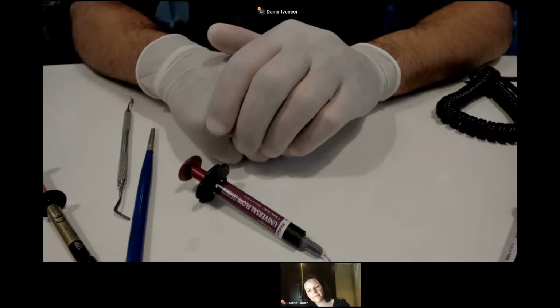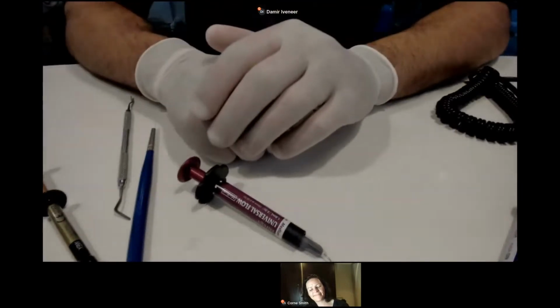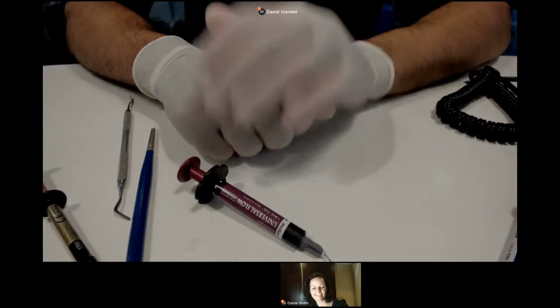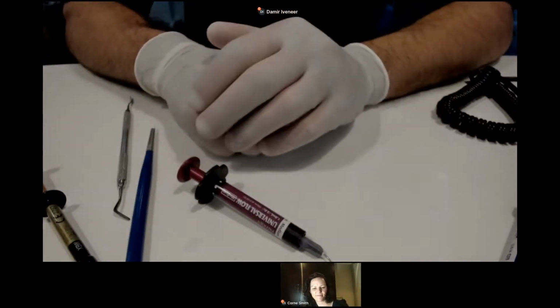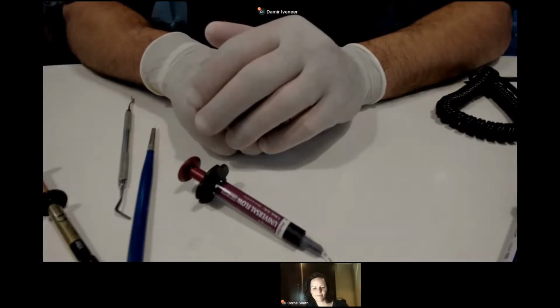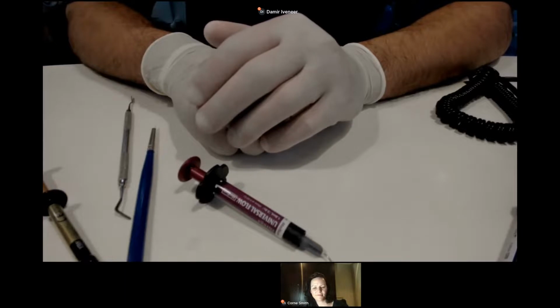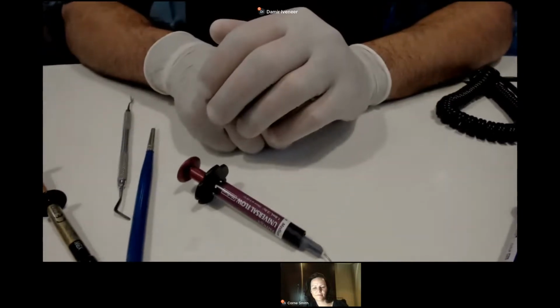Okay, so when you have grinded teeth or erosive teeth, I know this is very challenging, but maybe the way I work is opposite from the rest. First of all, I build. Then I take care of the reduction or the occlusion, okay? So this is my way, but I remember that I have to make some adjustment sometimes to the canine for canine guidance. So I have to work on the canine, so I will have a canine guidance.